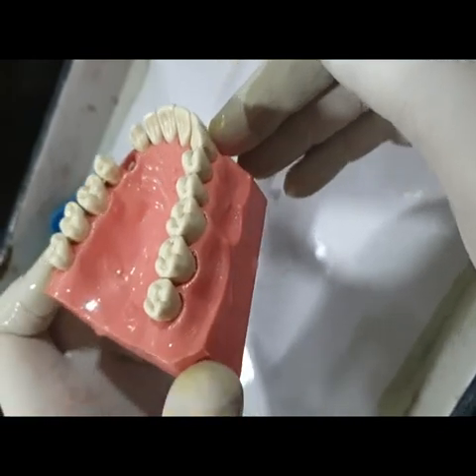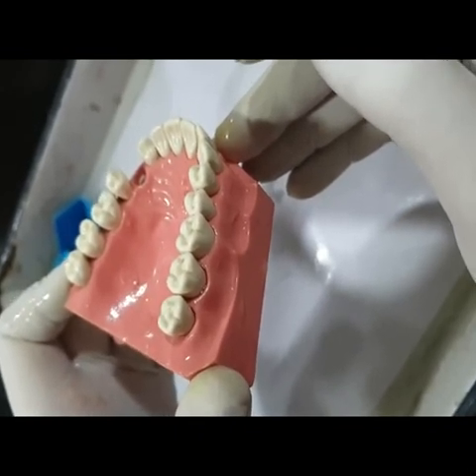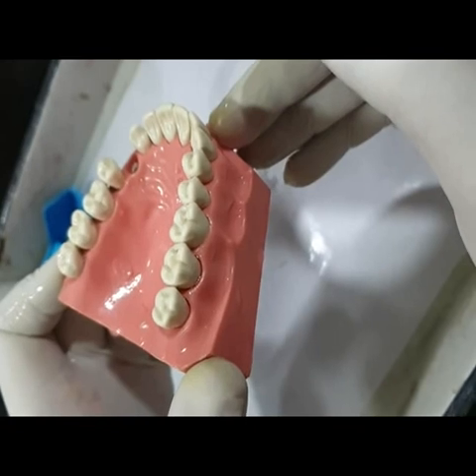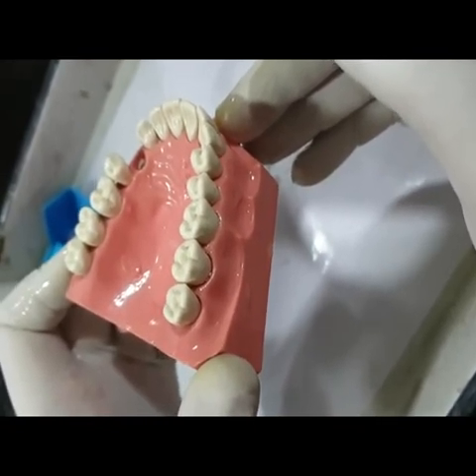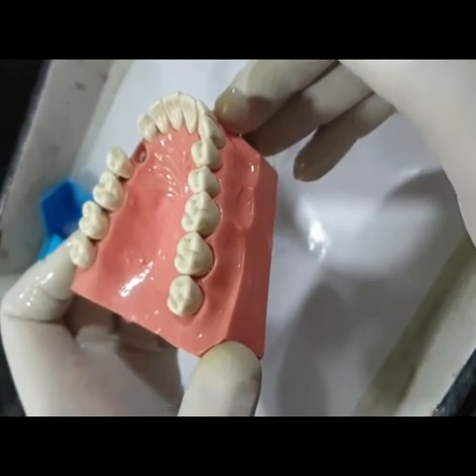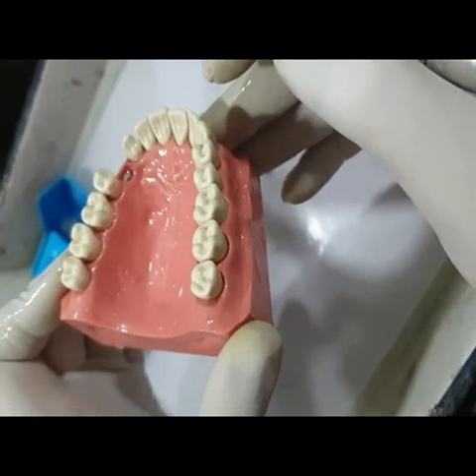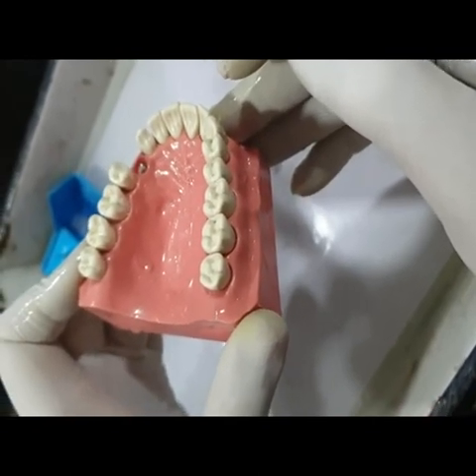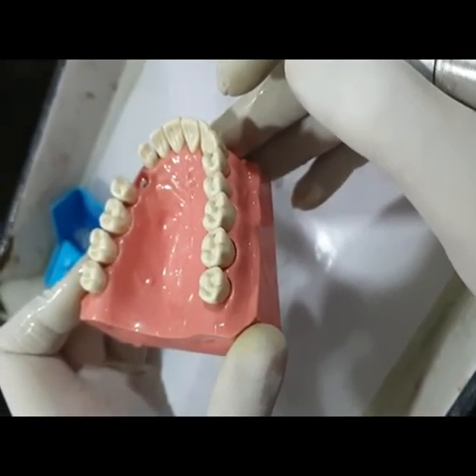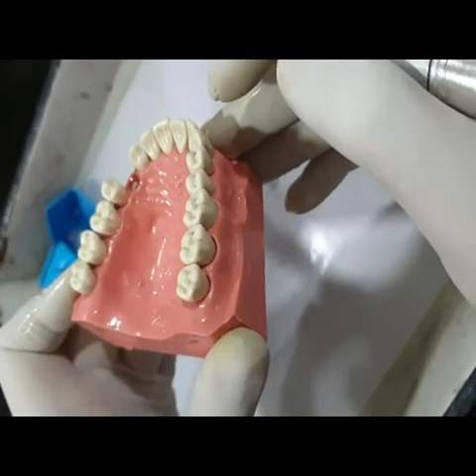Coming to the palatal side, the only difference from the labial side is we first prepare the margin. For preparing the margin on the palatal side, instead of using a flat end tapered bur which creates a shoulder margin as on the labial side, we create a chamfer margin. In a chamfer margin, we can accommodate less amount of bulk. Since this is an unaesthetic area not visible from outside, we reduce less structure — hence our choice of chamfer margin, achievable with a torpedo bur or round end taper bur. You take half the thickness of that bur inside the tooth and prepare the cervical area.